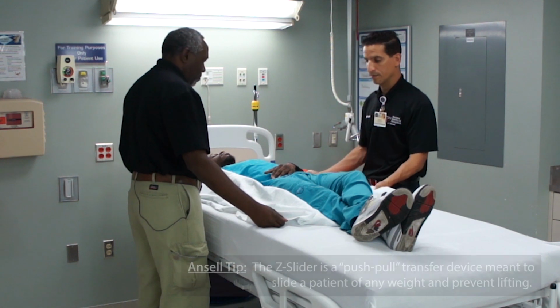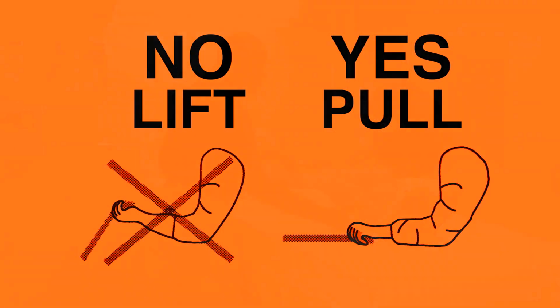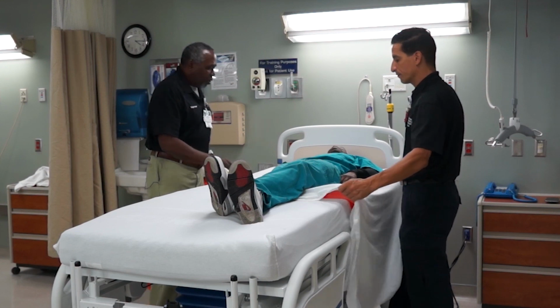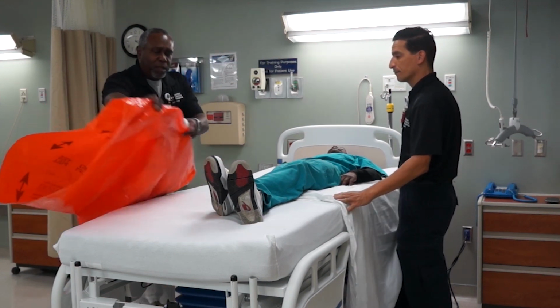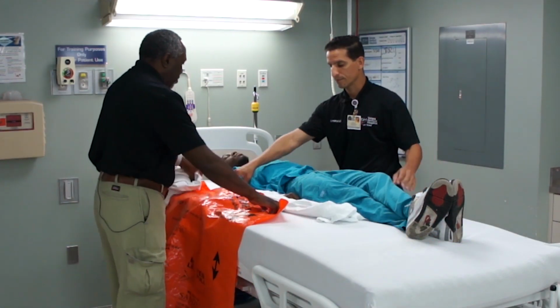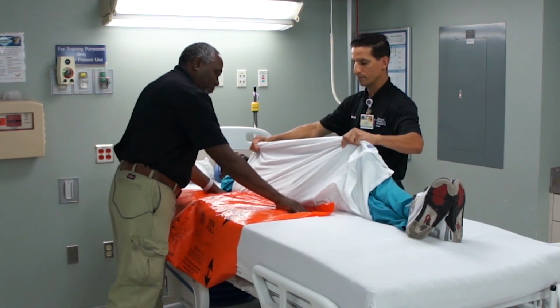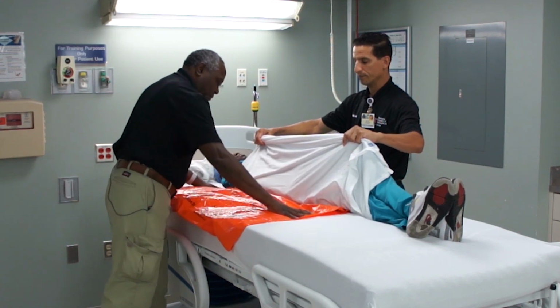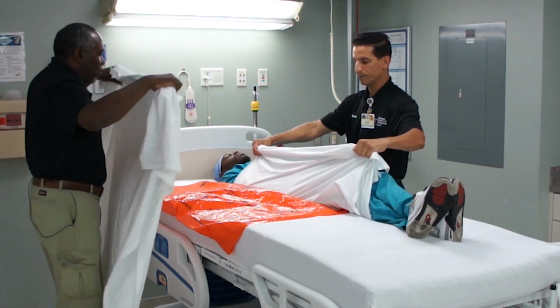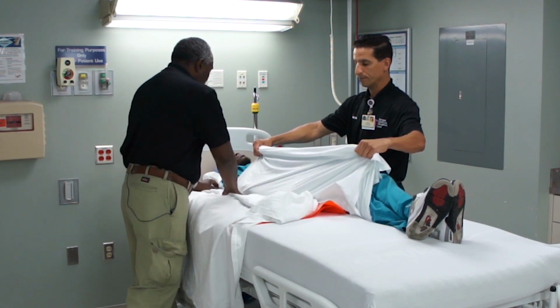The Z slider is a push-pull transfer device meant to slide a patient of any weight and prevent lifting. Now that we have the patient to the edge of the surface, I'm going to take another draw sheet and a Z slider. I'm going to place the Z slider underneath the initial draw sheet. I have the arrows aligned laterally, and I'm going to take another draw sheet and put it underneath the initial one.